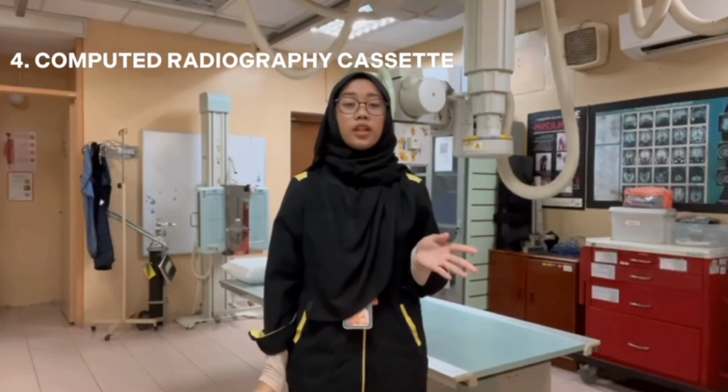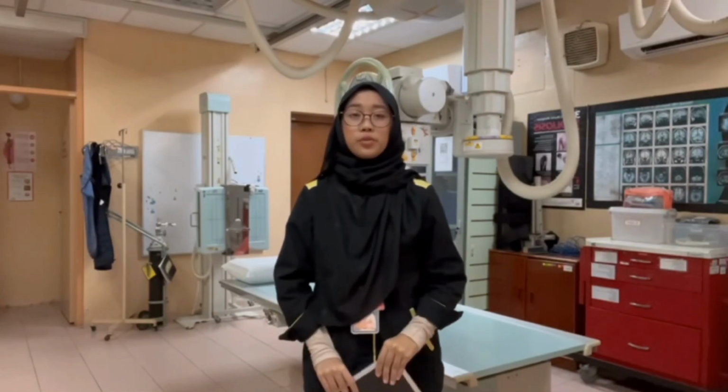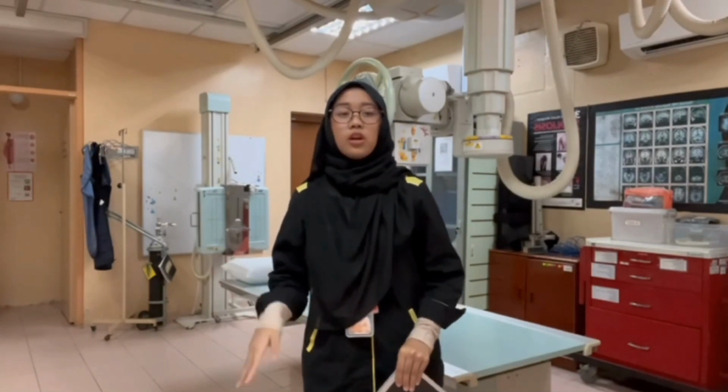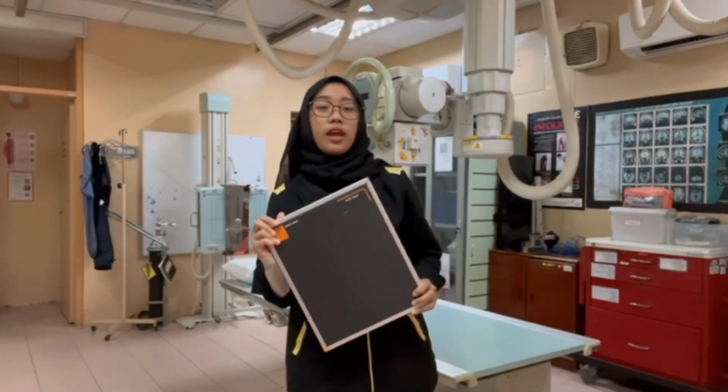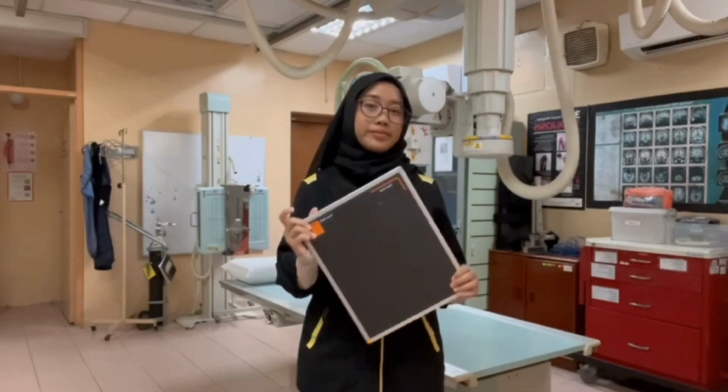Captured X-rays are converted into an image by the image receptor. Modern systems use digital detectors or computed radiography, but in our hospital, we are using computed radiography, making the process faster and more efficient than traditional film.